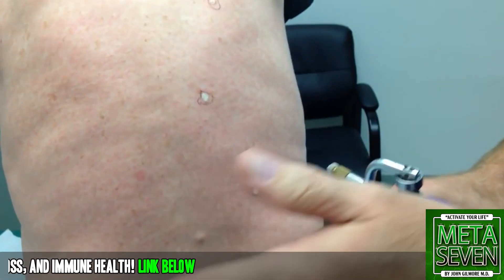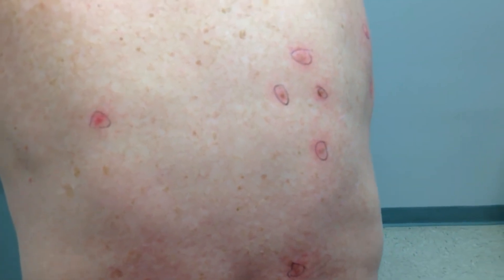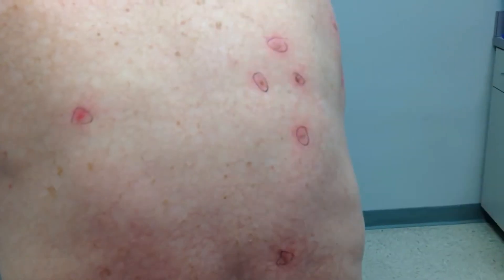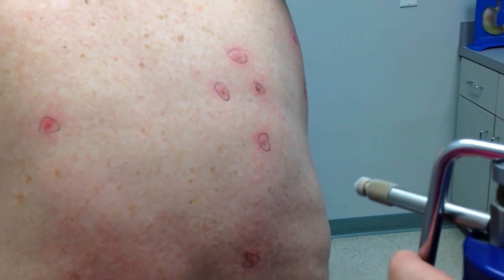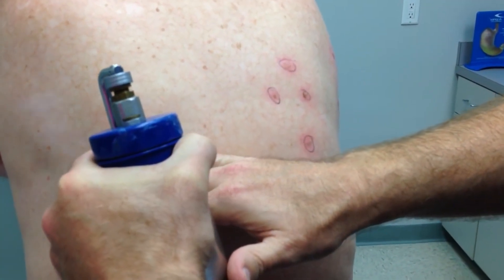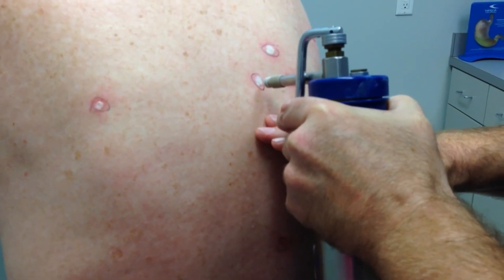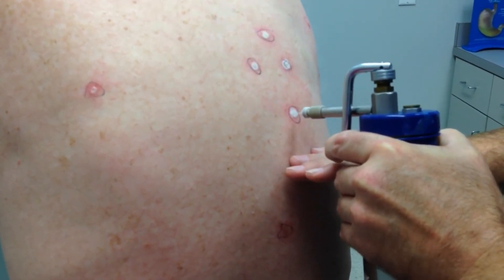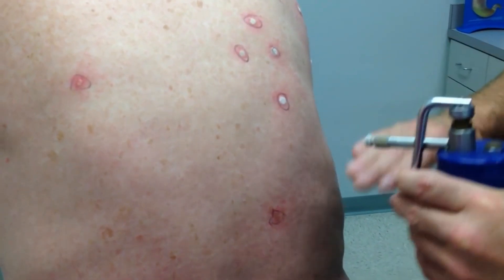Let's do a timeout now — zoom the video closer so you can see. With these actinic keratoses we have to complete two freeze-thaw cycles. We've done one, and by feeling we can tell they've warmed back up and thawed. Now we're going to start the second round of freezing, which unfortunately has proven to be more painful than the first one. Was it more painful? Not able to speak, apparently. Yes, that's more painful — I told you, I'm nothing if not honest.